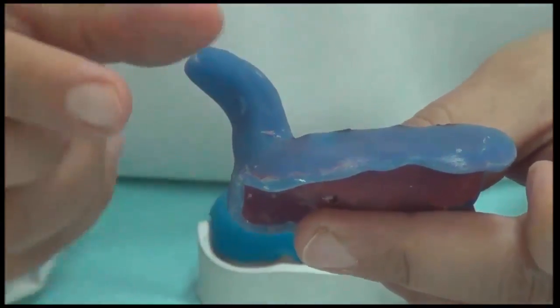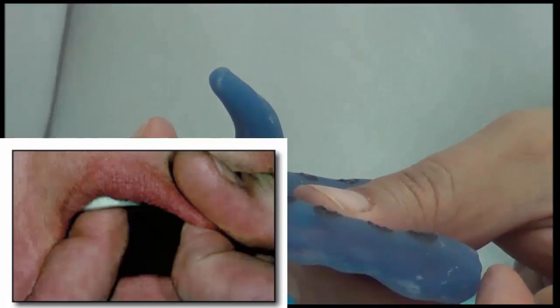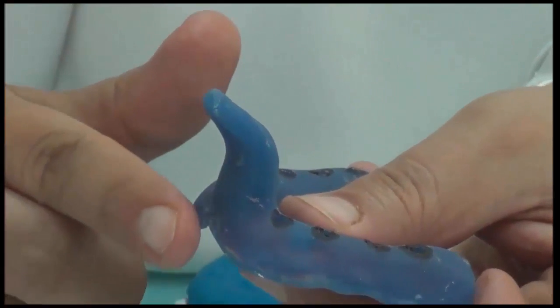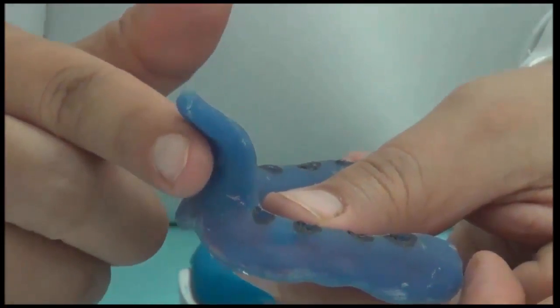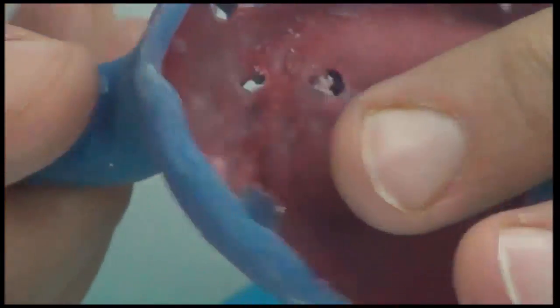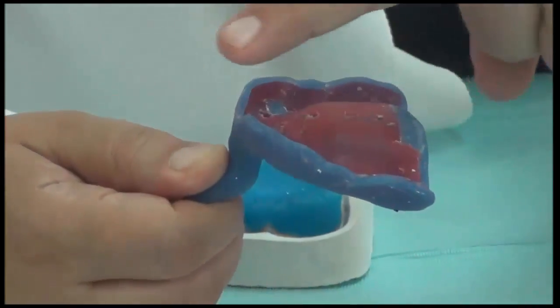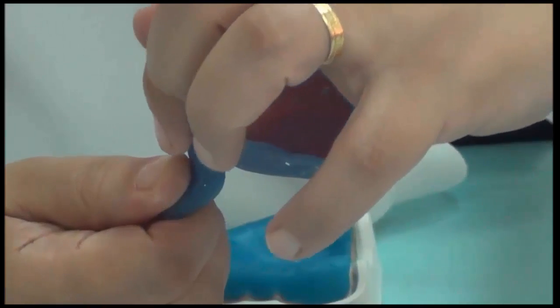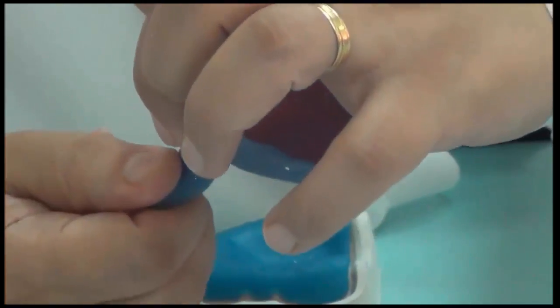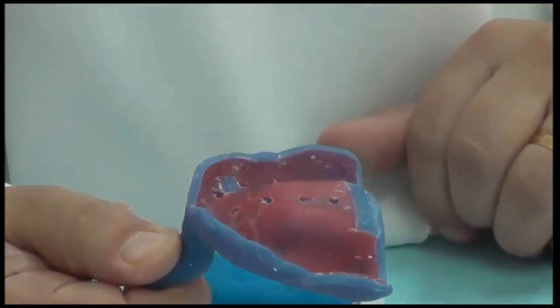We need to make sure that the handle can accommodate the lip without distortion. If my handle is going to the outside, it will interfere with the lip of the patient. So we need to make sure that the handle is clear from the lip by making the first part of it vertical, and then we rotate to the outside just to make enough of a grip while holding and taking the impression. If the lip is inside the patient's mouth and the lip is here, you can notice that the lip will be resting without any distortion or movement. So I could hold my tray, insert it, and take it in and out without distorting the lip. This will aid in an accurate impression as well.